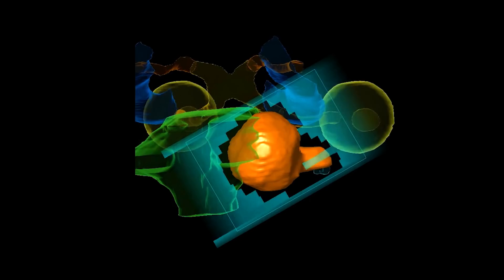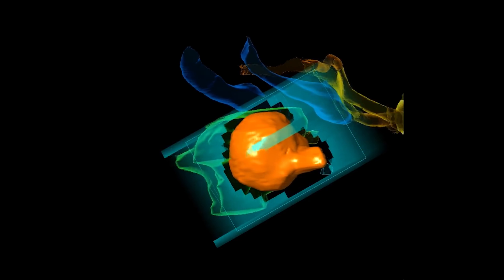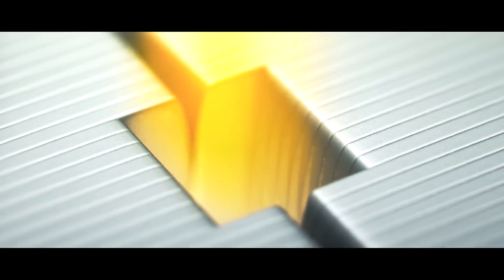The multi-leaf collimator allows us to vary these shapes according to the view of the tumor. Because we can't use magnets to steer x-rays and we can't use lenses like light, what we have to do is simply block the regions where the x-rays aren't supposed to go and create an opening where they are supposed to pass through.